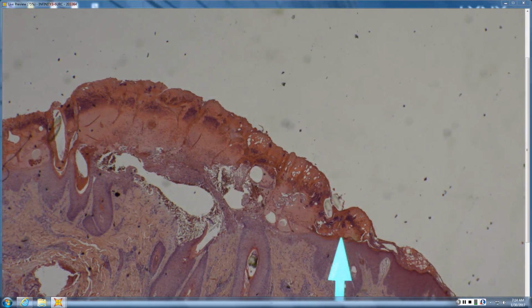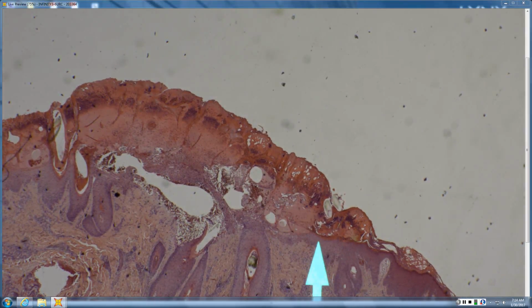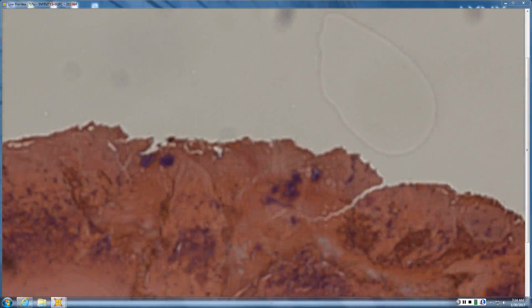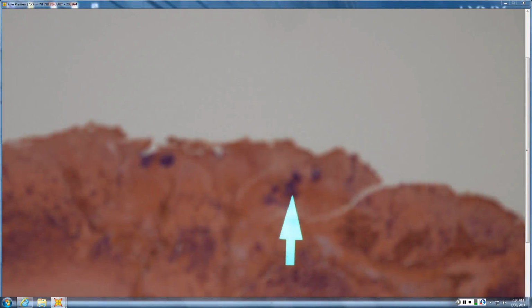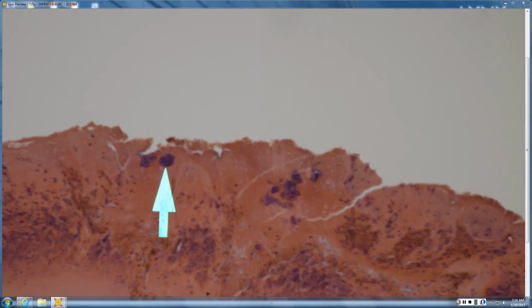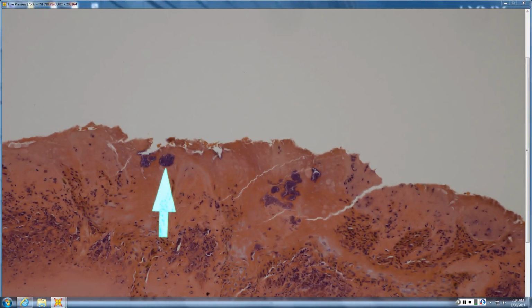And impetigo can be bullous. This isn't really forming true bulla, but you can get bullous impetigo. And then what you see here are the organisms. So all these little blue collections. This is the staph organisms that's causing the impetigo, that honey-colored serum crust that we see clinically. And so that is the impetigo. So those are little colonies there.